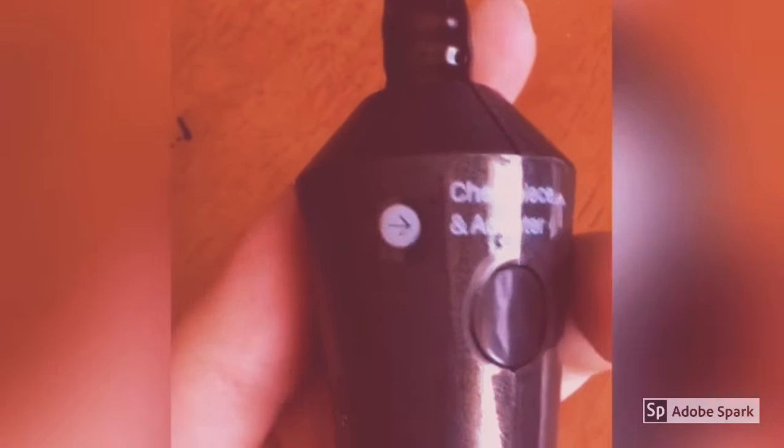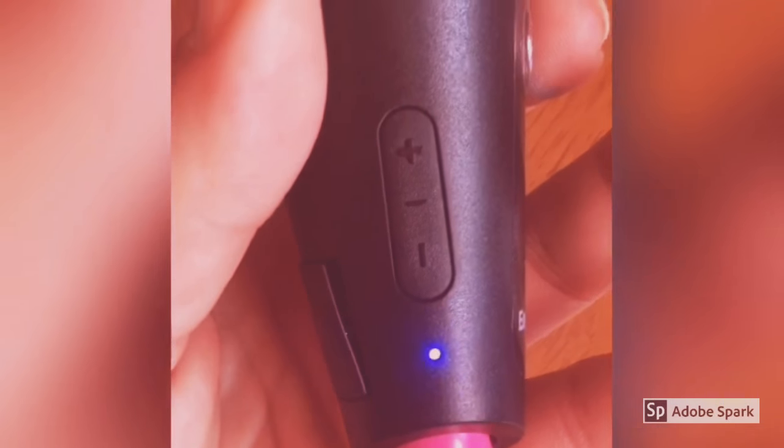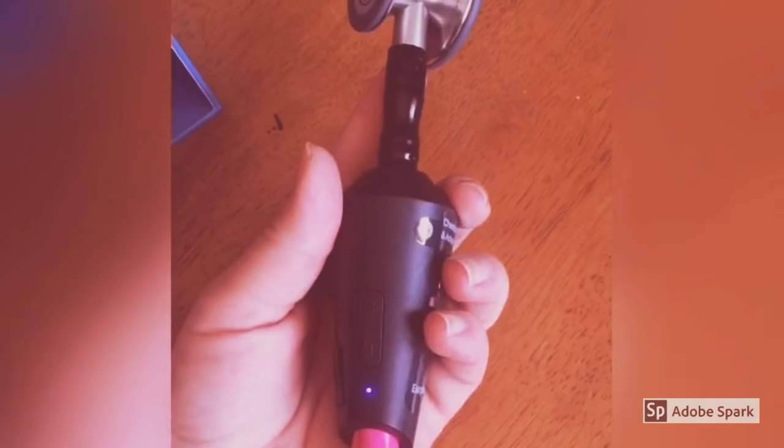Now getting to how it works — we've got this little button. We click it on and there's the light; the light tells us that it's on and charged. That's cool. And I like that you can still click between the bell and the diaphragm without any real change to the way it moves.